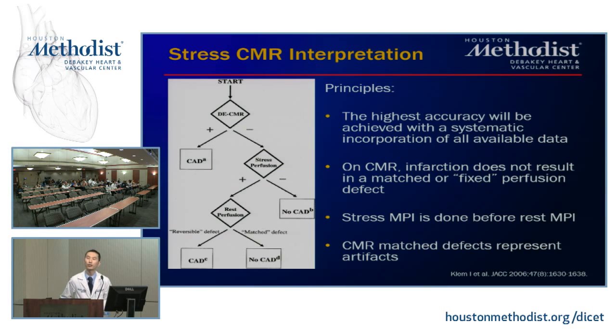I beg your pardon, Dr. Chang? How do you deal with non-subendocardial enhancement? So the question is, how do we deal with non-subendocardial delayed enhancement?